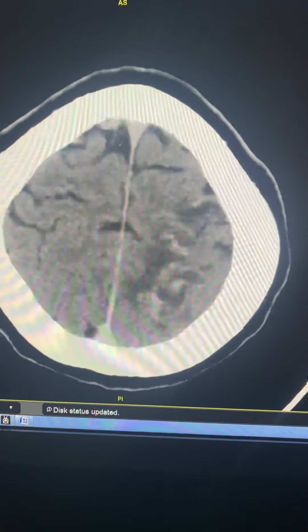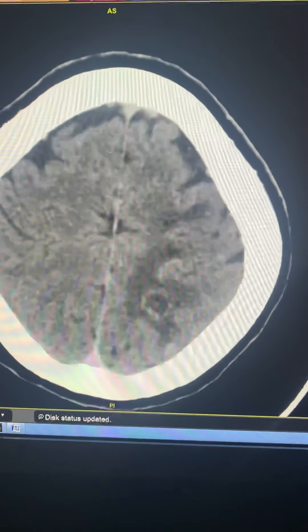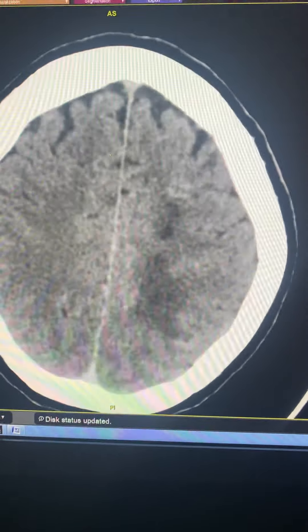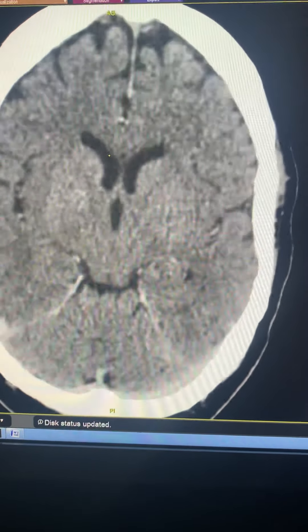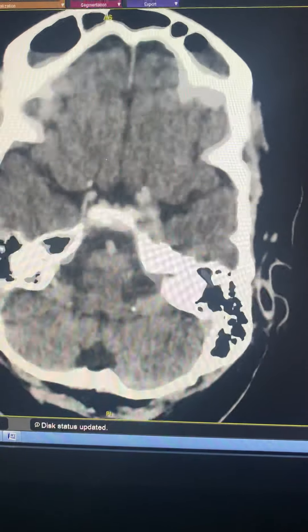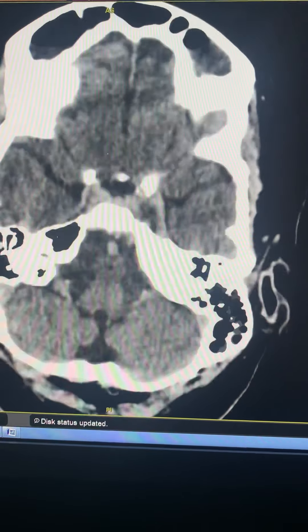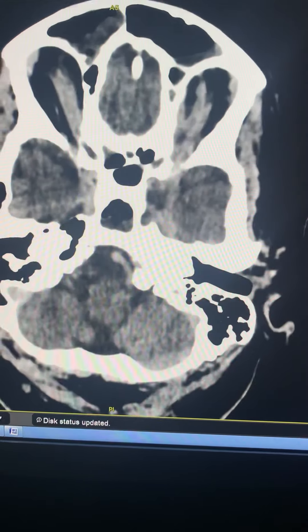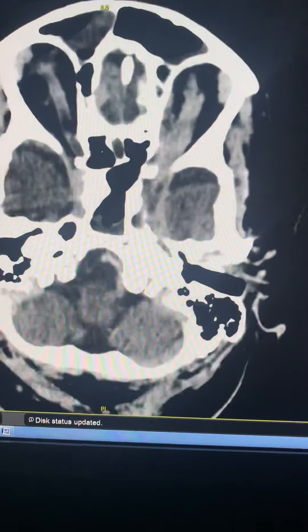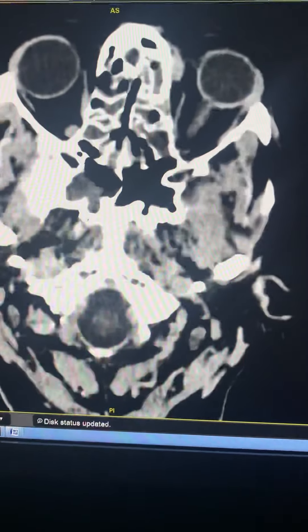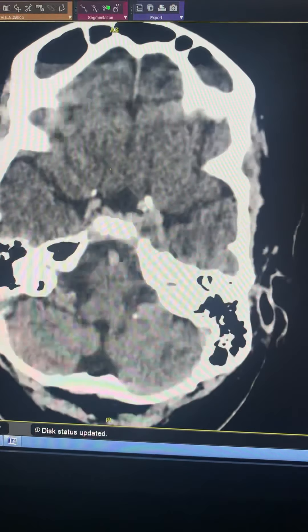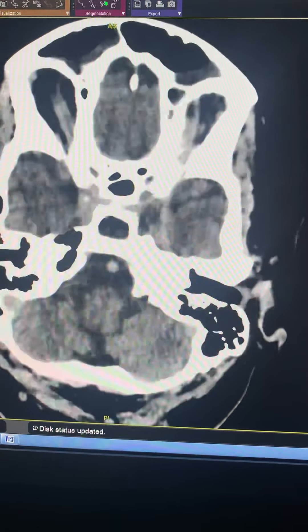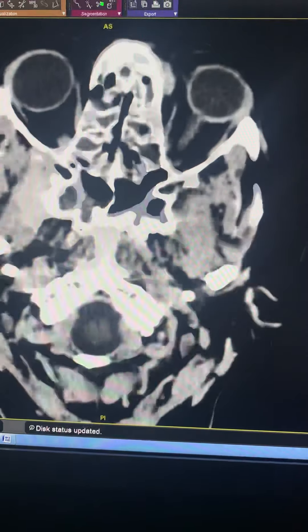On post-contrast CT, gyri-form enhancement is seen, consistent with a subacute infarct. This is a left MCA territory subacute infarct secondary to thrombosis of the left internal carotid artery due to this invasive fungal infection — a typical case of invasive fungal sinusitis, mucormycosis.